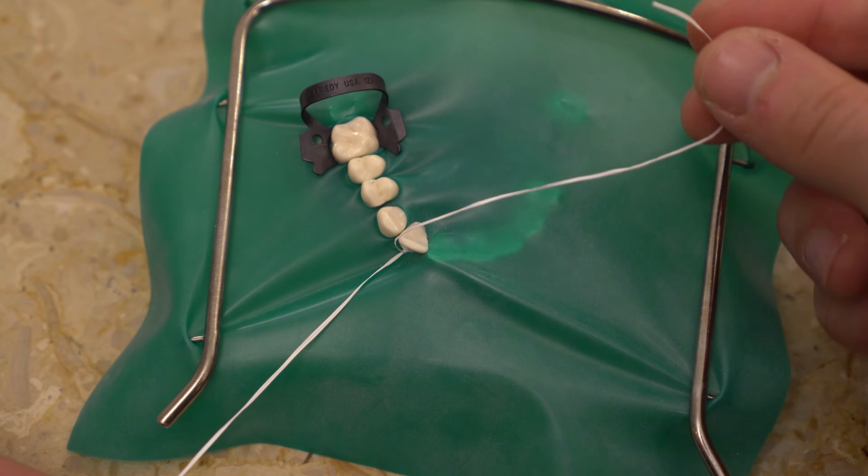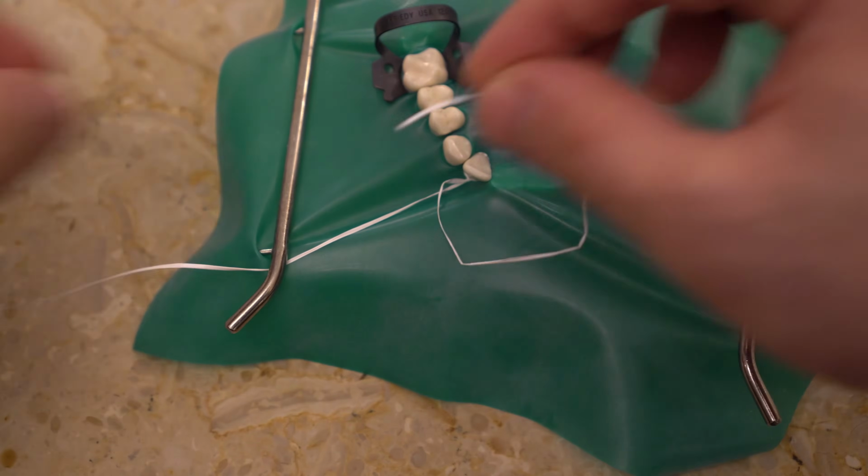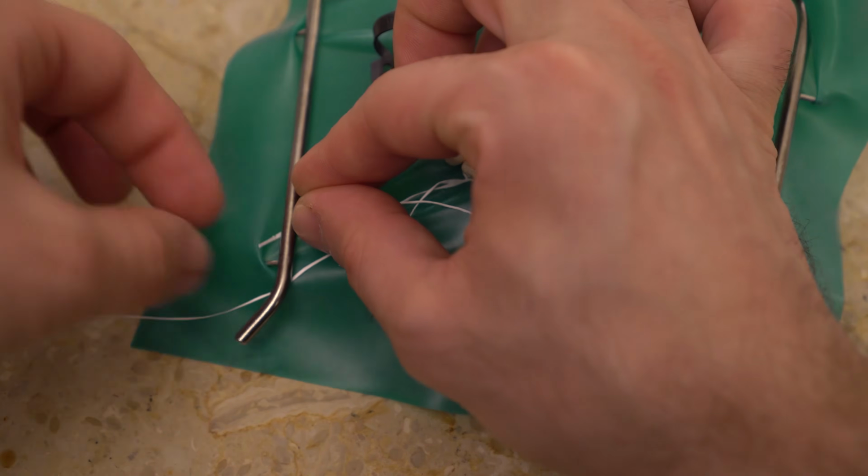So our first tip is to tie the floss tie to the rubber dam frame. When we do floss ties on anterior teeth, sometimes the extra bit of floss can get in the way. We can cut it short, but sometimes it can be difficult to remove at the end of the treatment. So when you put your floss tie on, tie it to the corner of the rubber dam frame as you can see in the video.